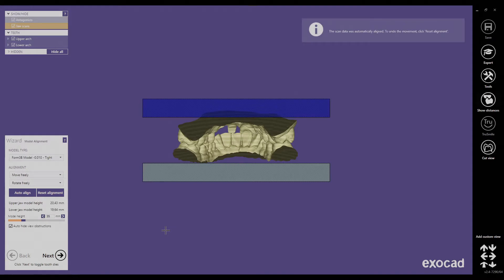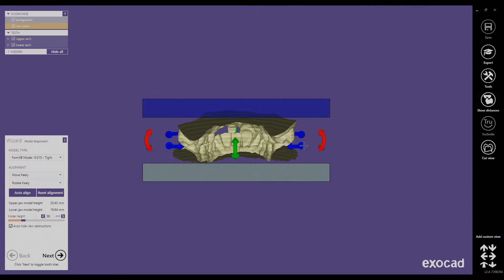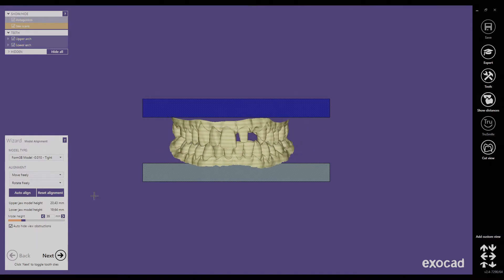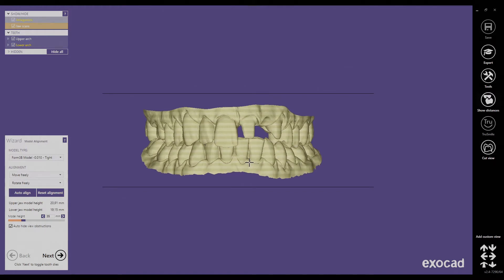Now we are in the alignment step. The imported scans are facing the wrong direction, which can be easily fixed by doing a control-click on the model and dragging along the Z axis. There is a window showing the height of the models in total and of each jaw. I like to have the upper jaw about 2 mm bigger than the lower jaw because of the overbite of the teeth, so I drag them down until we have about 2 mm difference.